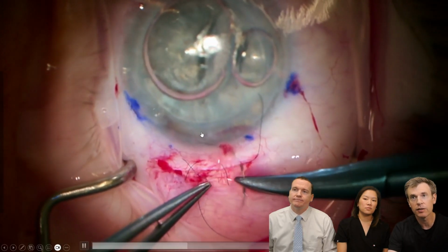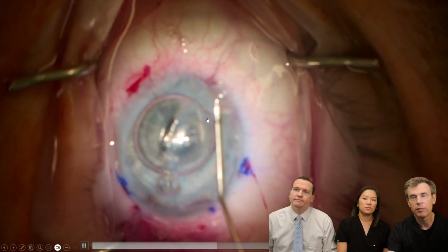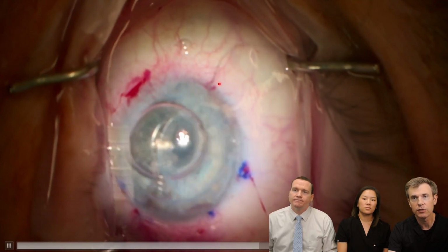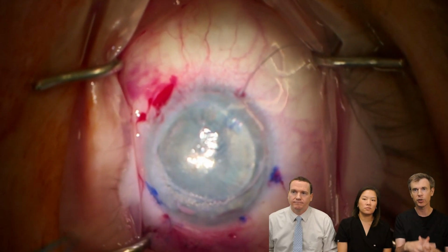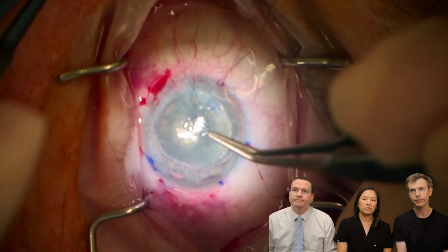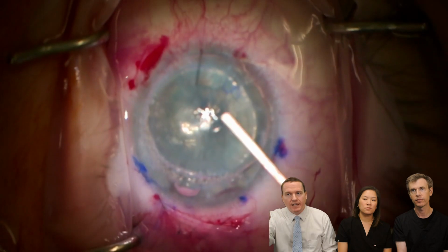Even there you can see that with the placement of the bubble, that graft is centered a little bit, can be recentered. Main wound is closed, but recentered from the outside. This is just a safety suture, but at the end, depending on the difficulty, sometimes a suture is placed that stays in there to make sure that the graft does not detach after surgery. Pretty common to see post-DSEK patients with a stitch in place.